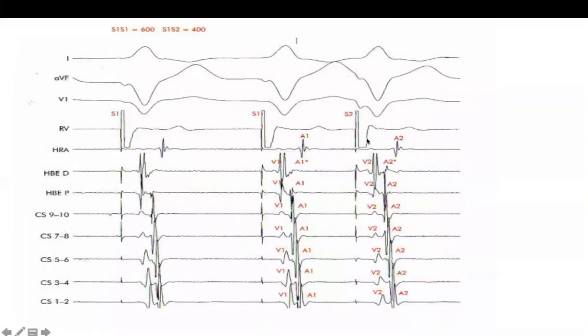Now the same thing that we are performing in the ventricle. If you pace in the ventricle, you expect retrograde conduction in normal people as well, probably more than 80% of the time. So V pacing, then atrial recording, V pacing, then atrial recording, because the conduction will go retrogradely through the AV node or the accessory pathway if there is any.